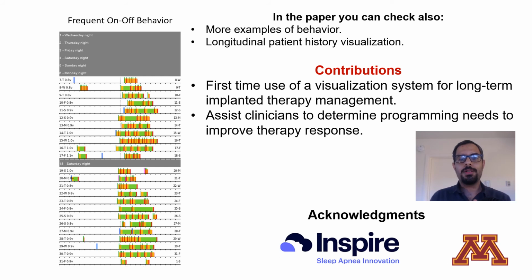In the paper, you can see other examples of behavior, and also we have a new kind of visualization tool that also helps the doctors to help the patient. As contributions, this is the first use of a visualization system for long-term implanted therapy management, which is new, and also we can assist clinicians to determine the programming needs to improve therapy response as they need.